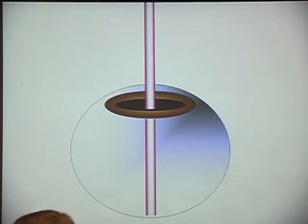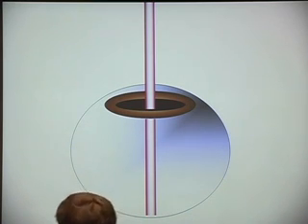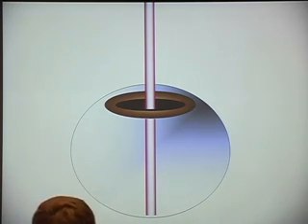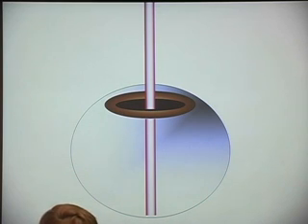So far, you've shown this emanating from one point in the back of the eye. Do you actually scan over the back of the eye? No, in this case. You could do that, and then you would be essentially measuring the errors at different angles in peripheral vision. In the fovea, you have most of your important cones in one small place. So for our purpose, what we cared about is just down the center, the line of sight. You could do that, and there's been some research into that, but your resolution is so low off axis that it's not as interesting. Oh, it's still interesting, but it's not what I did. What we were doing was a single point.